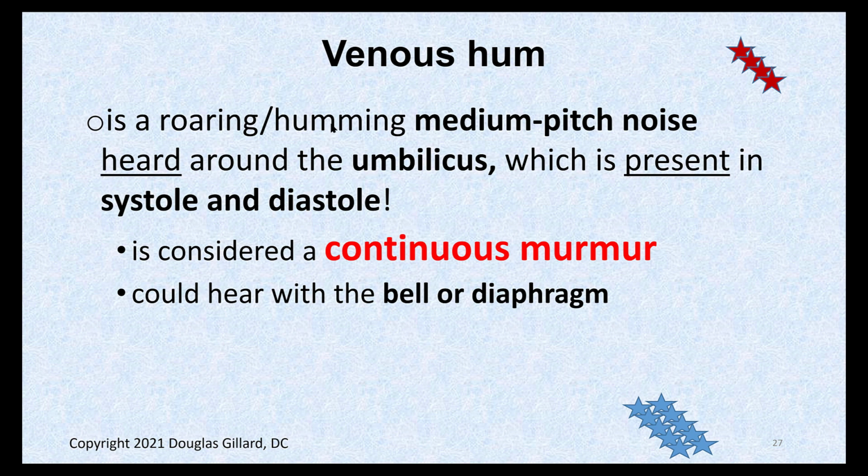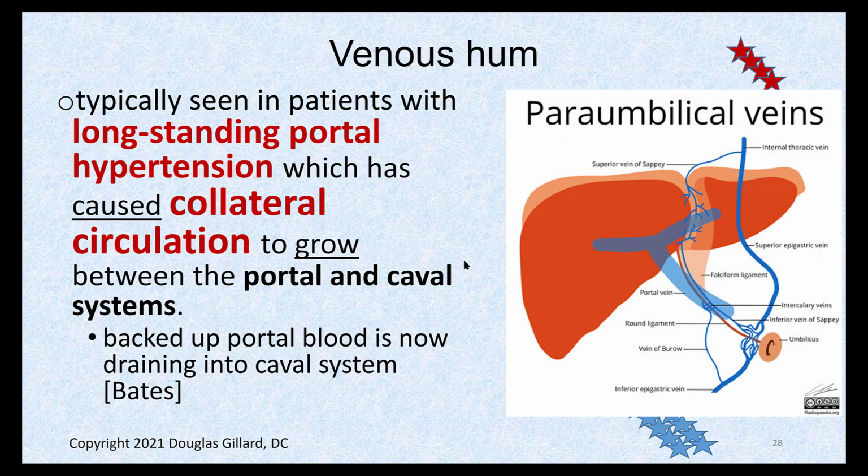Kind of like a roaring or a humming sound. Kind of tough to imitate that one. But it won't be a systolic sound. It'll be a pan sound. A pan all the way through. So continuous. It's a continuous murmur.